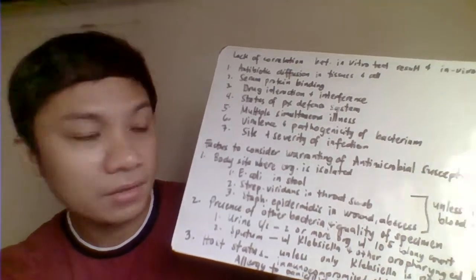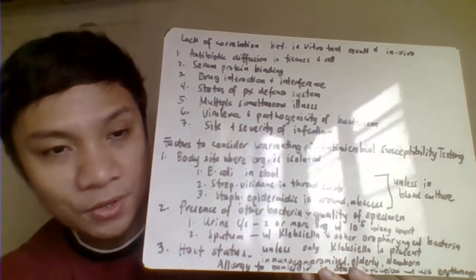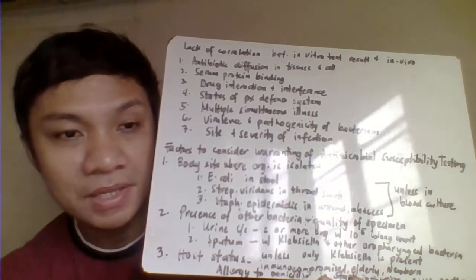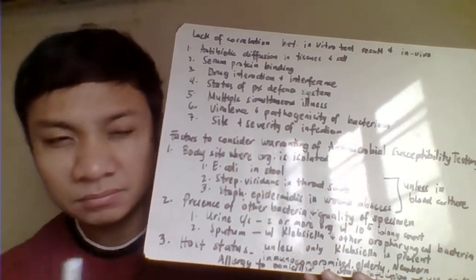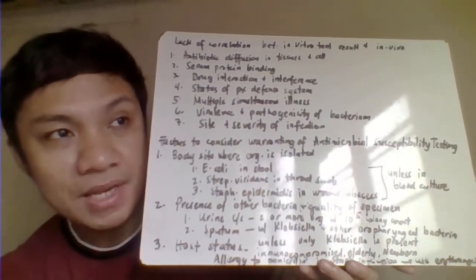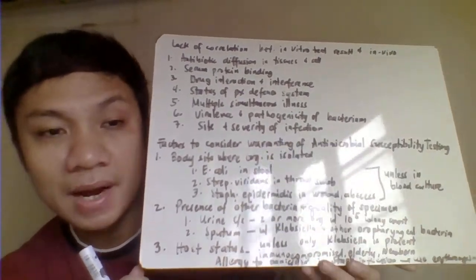Okay, then we have here the factors to consider when we are going to perform antimicrobial susceptibility testing. Okay, so hindi lahat after you have isolated your bacteria in your different culture media, hindi lahat or would eventually be you proceed with the antimicrobial susceptibility testing. Okay, so sometimes you need also to differentiate if that one is really the one causing the infection or is that a contaminant. Pag contaminant lang, we're just wasting our time, di ba?